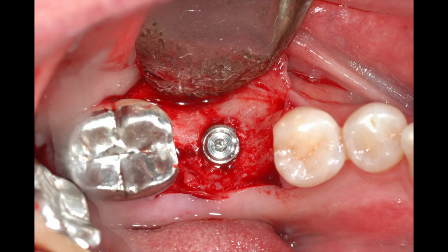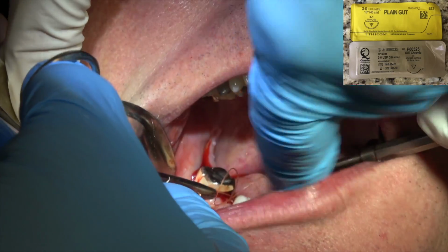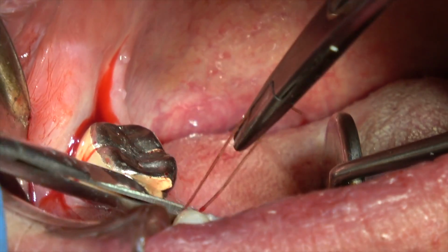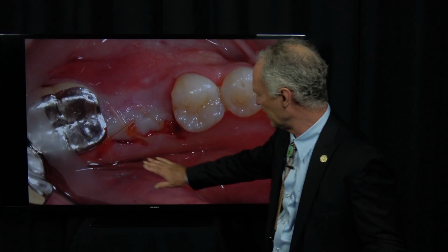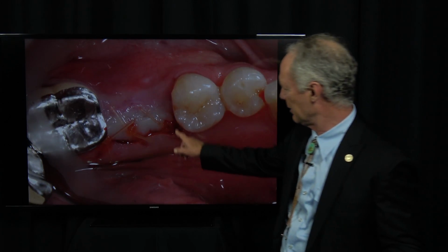It's just perfect. Then 3/0 gut suture. And you will have primary closure. Remember, you're reflecting the flap from the lingual, so you're just having to reflect one flap. You can see we're sutured over here on the lingual. Now, not so far to the lingual that you take a chance on damaging the lingual nerve, but I'll put 3 interrupted suture.